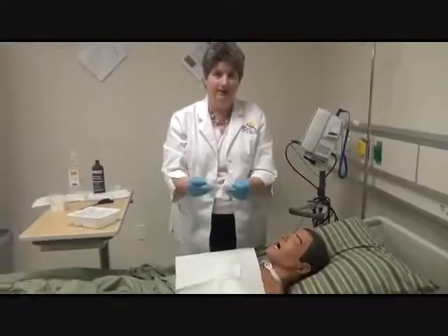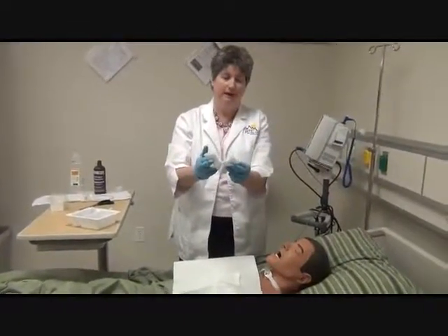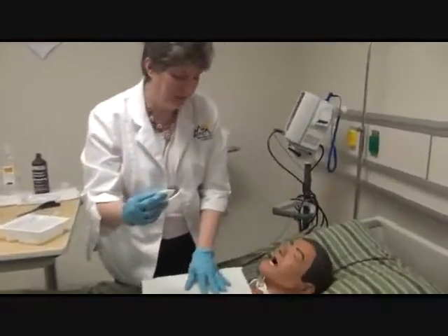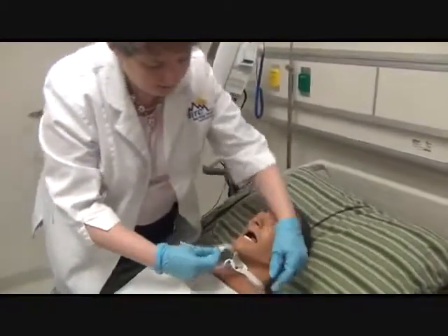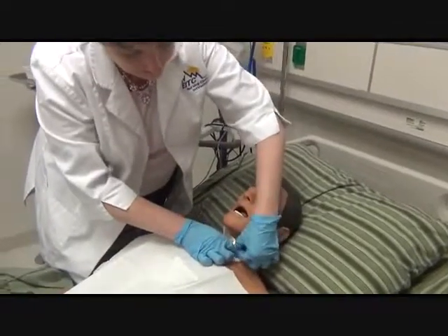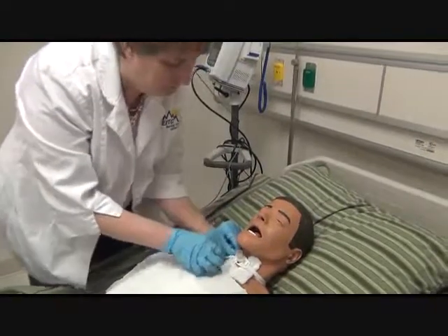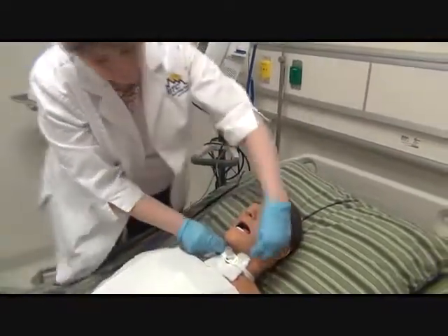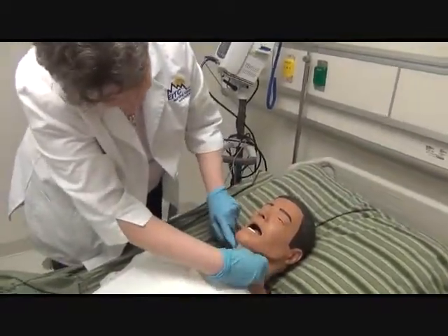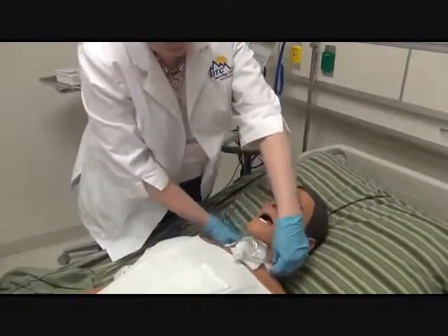So now we're going to take your gauze that's going to go around the trach on the outside, called a drain dressing. So it has the little split. And at this point, we're going to just tuck it in up underneath those little ties. Just make it look nice and neat. Again, return your oxygen or your humidifier.